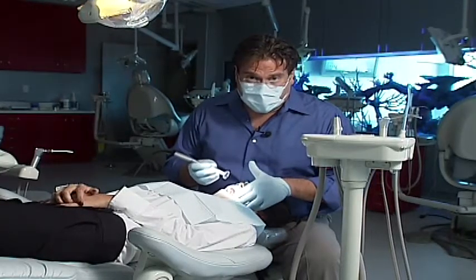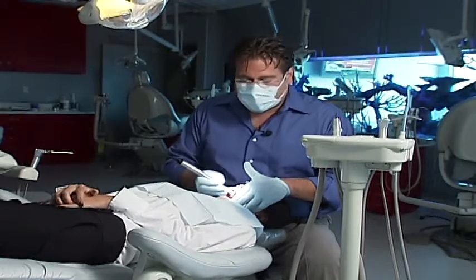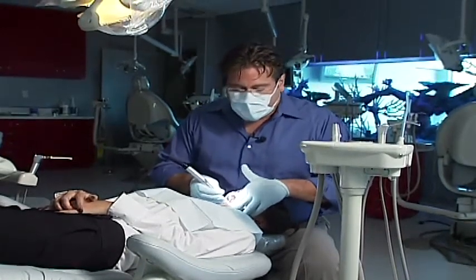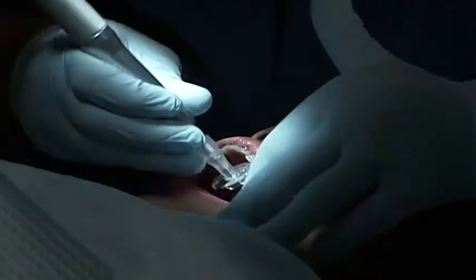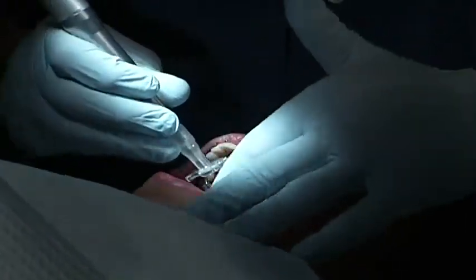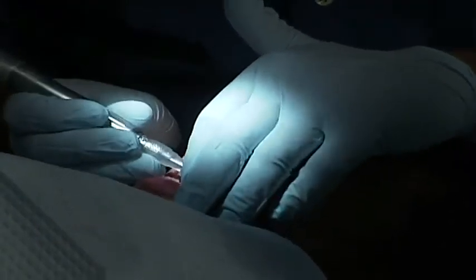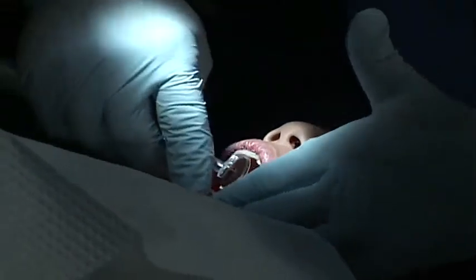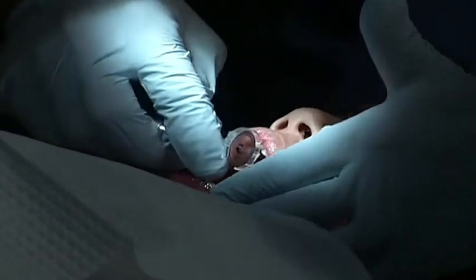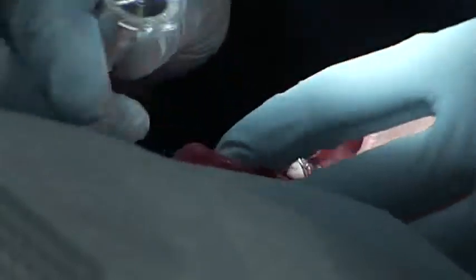For the mandibular left quadrant, I'm also at the 12 o'clock position. My finger on the left hand holds the cheek out of the way while also resting the guard on it at the same time, and I move through the mandibular left quadrant. When I get to the anterior teeth, I move the handpiece into the right hand and go through interproximally on all the anterior teeth in both quadrants.